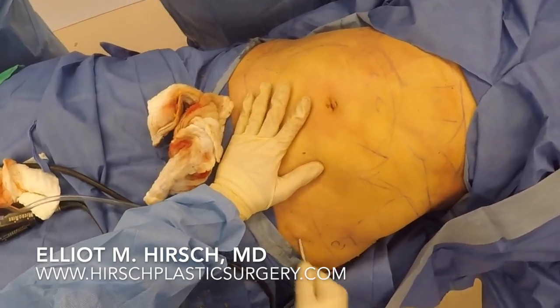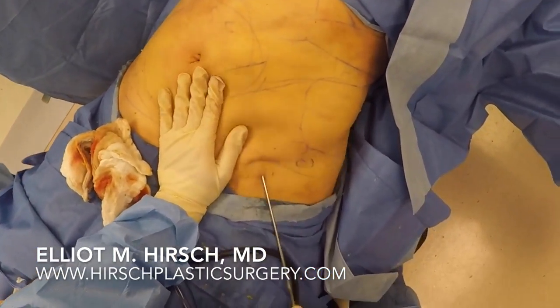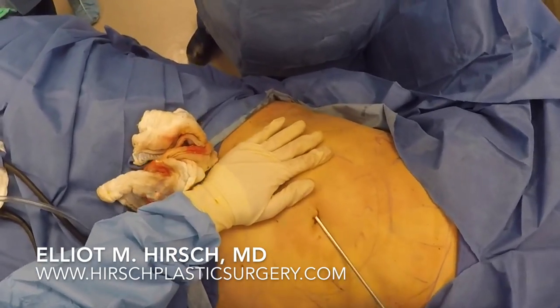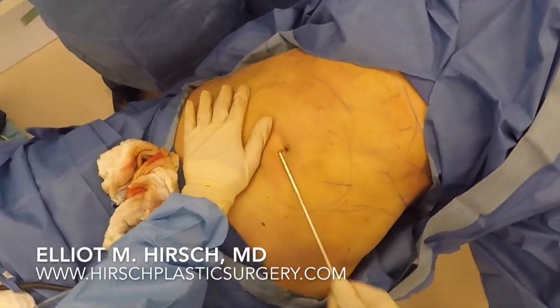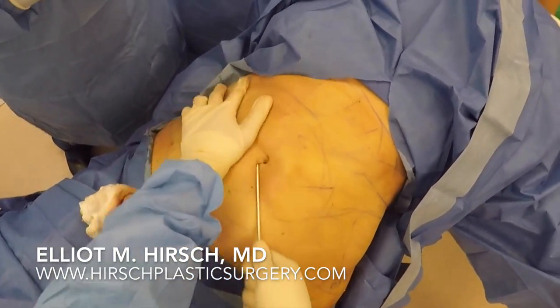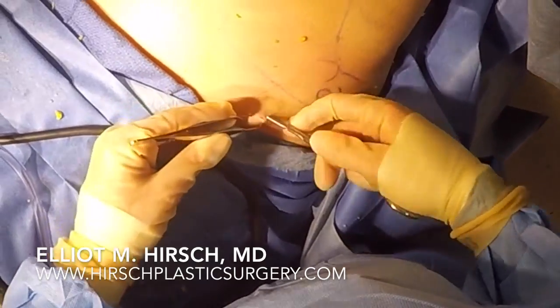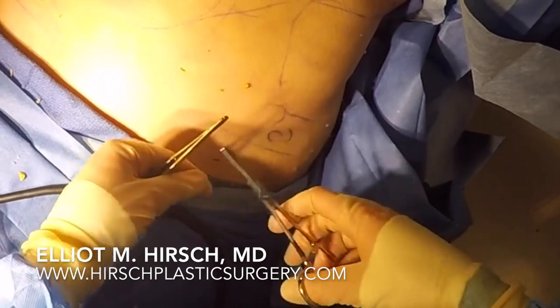Once the planned amount of fat has been removed, the exploded tip cannula is placed once again and is used to break up and smooth out the remaining fat. This helps achieve a smooth contour and minimizes deformities. Finally, the cannula insertion holes are closed with simple suture.